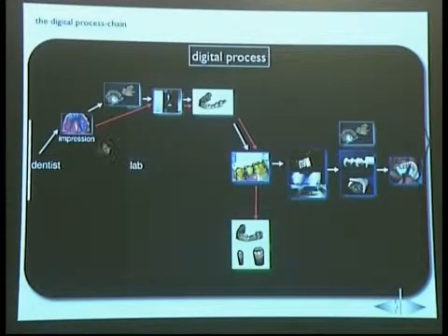For the impression scan, we need one step more. If we need a model, and in most cases we need a model, so if we go to bridge work, then we have one step more. We need to make a model, a virtual model, because what we get up there is not a model. This is only a surface scan. It's totally different. So this is the next step in this process chain. We have solved something here to create the models, but we must do them here. Next step, doing a model.